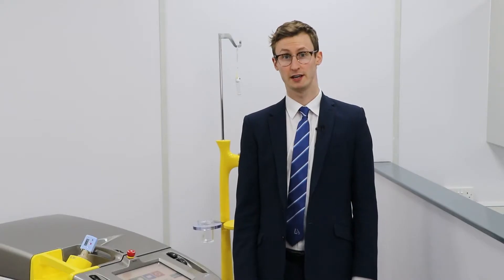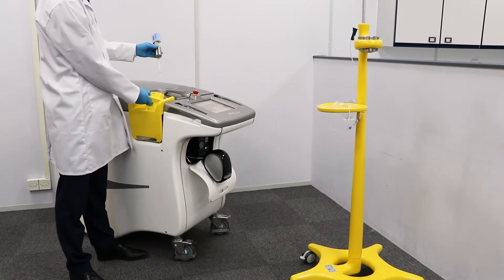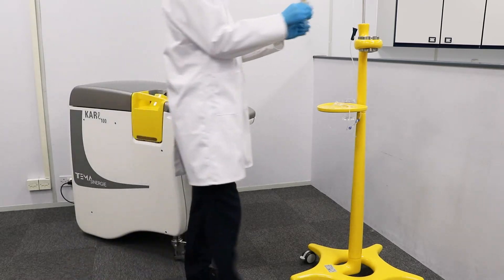Once the radiotracer is loaded into the rad inject, the operator may double check the dispensed dose using an external dose calibrator. The 1kg injector can then be transported to the stand alongside the patient.